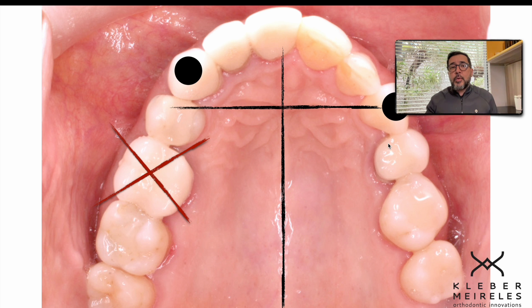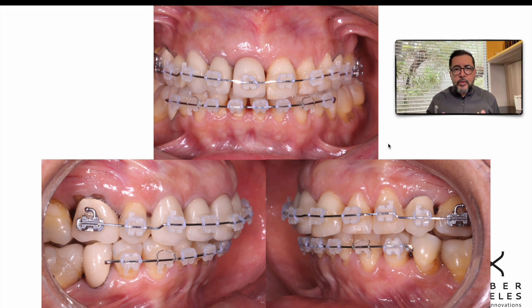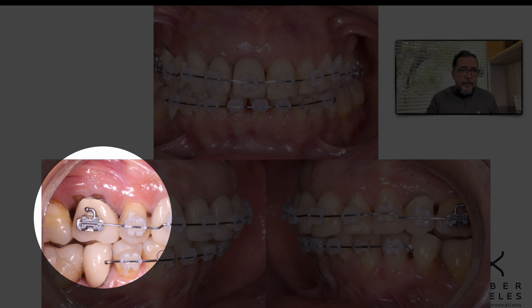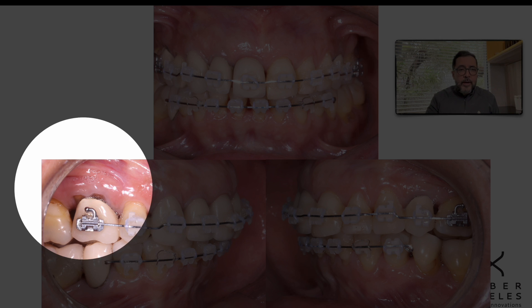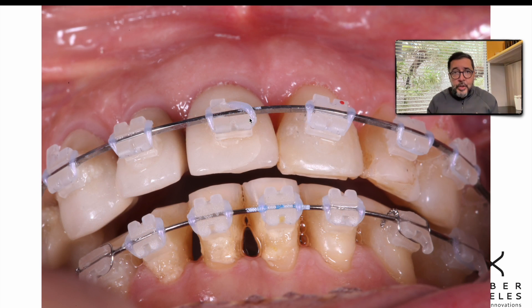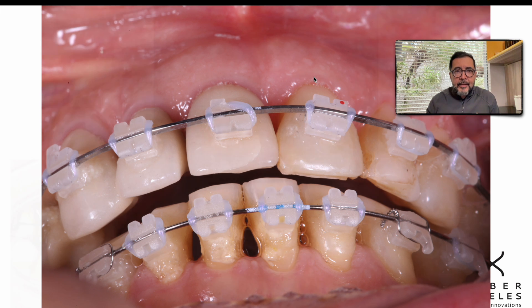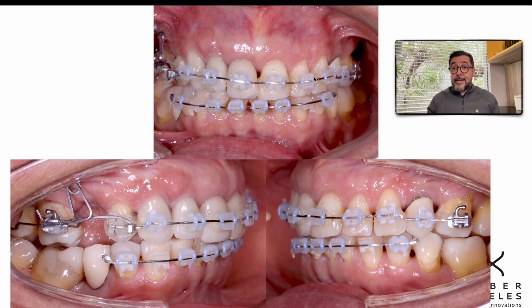I use the specific anchorage that I need. In this case, I didn't need much anchorage because I wanted to close the space from mesial to distal and from distal to mesial. First of all, I had to give a good overjet to the case so I could do the retraction. We initiated the case just doing the leveling and aligning, and it was planned since diagnosis to do the extraction of this upper molar on the right side. But before that, I needed to give an overjet by applying the correct torque. I applied the torque with TMA in cases like this, because I don't want to force to engage the bracket, and the TMA can apply good torque when we wait some time for the torque to be expressed.